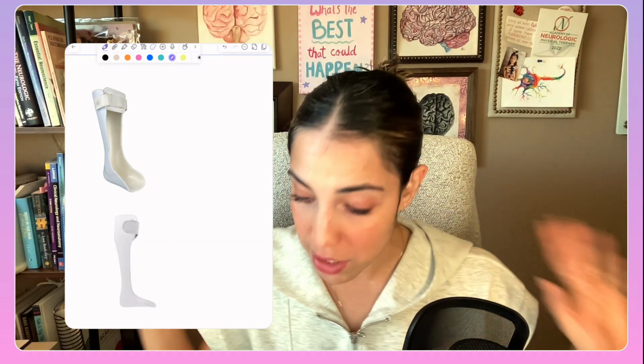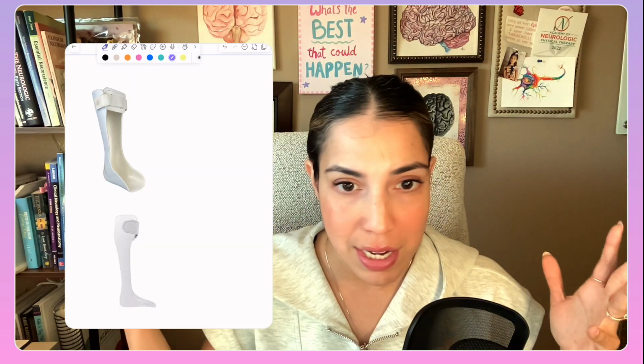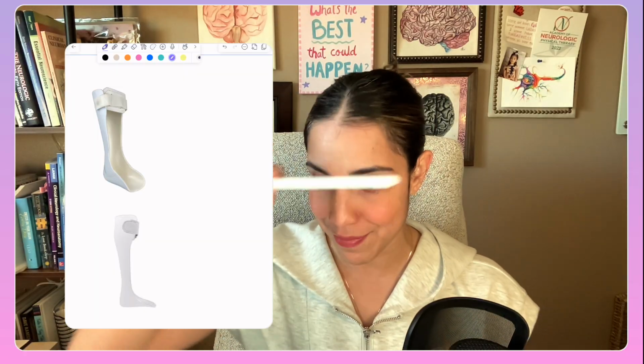We're going to dive in. We're going to talk about solid AFOs, guys. Solid AFOs. Now, I wanted to start with the easier one. I think this is the easiest one because it's pretty straightforward. There are a few things that you need to know about solid AFOs. And I'm looking down because I have my iPad here and my pen.